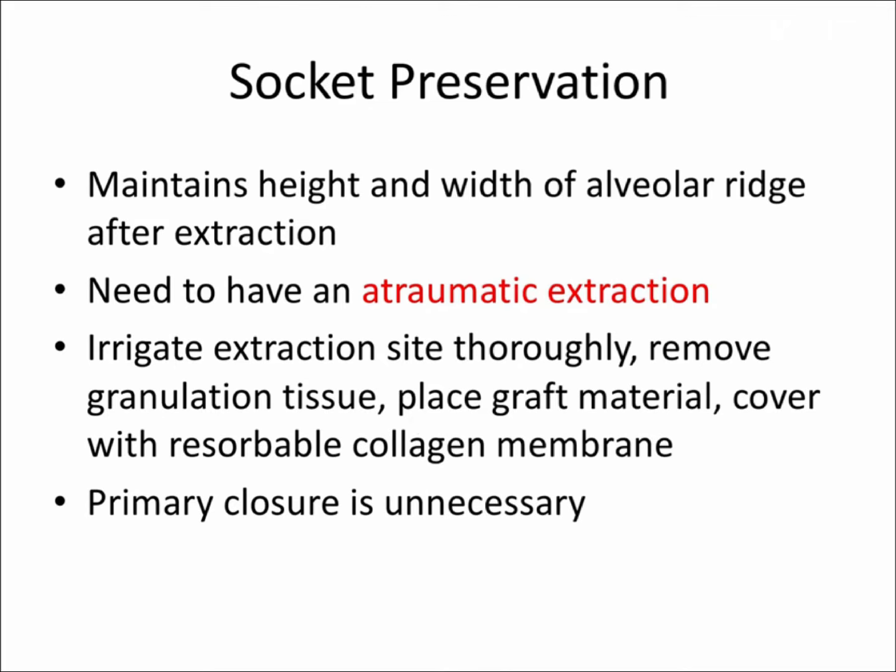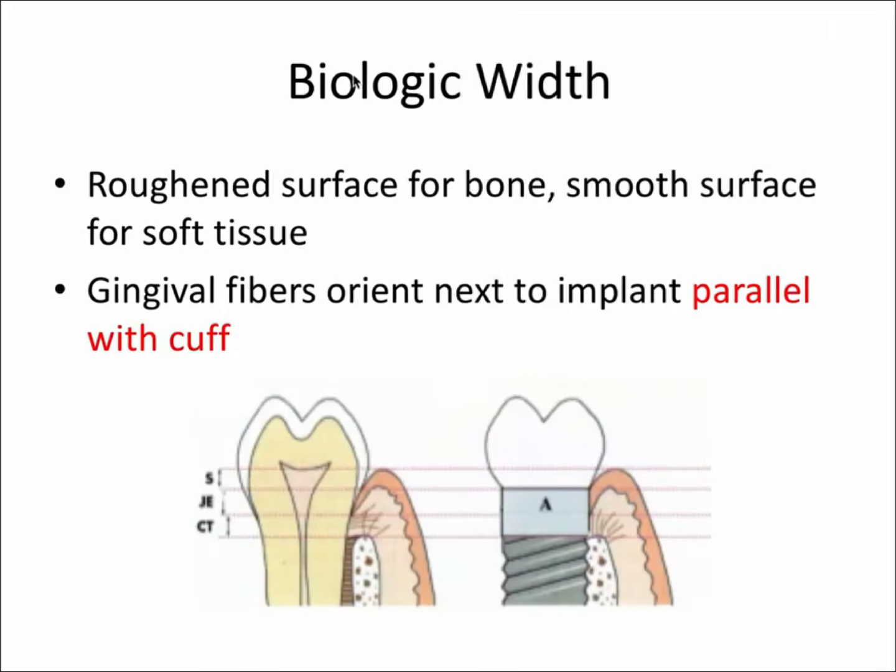It's a similar process. We want to regenerate the bone in that area to help fill in that socket, but also to limit any bone loss in a buccolingual or occlusal direction. Primary closure with this procedure is actually unnecessary.